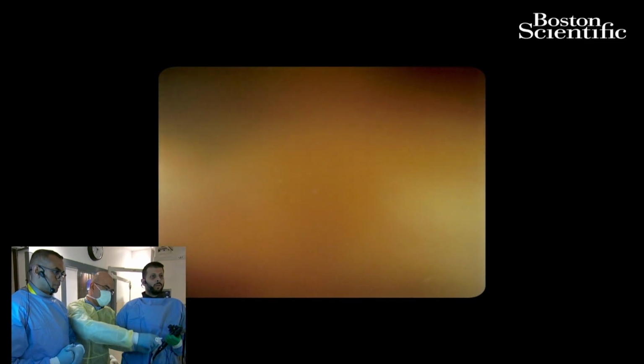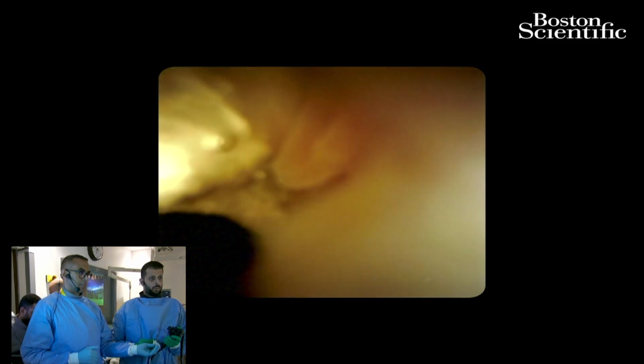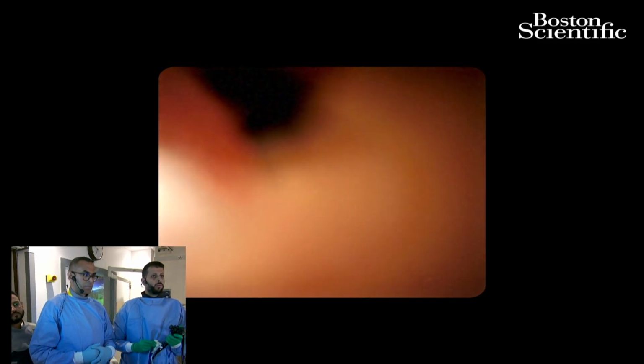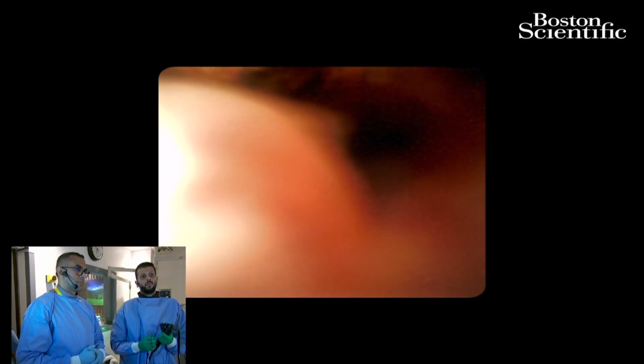When you remove the plastic stent, I can see the duct, and I can see the common hepatic, the right and left hepatic ducts. So my thinking is, as you said, there is no stricture. It is just post-inflammatory. And now the man is alive, and there is no lymph node and no complication.